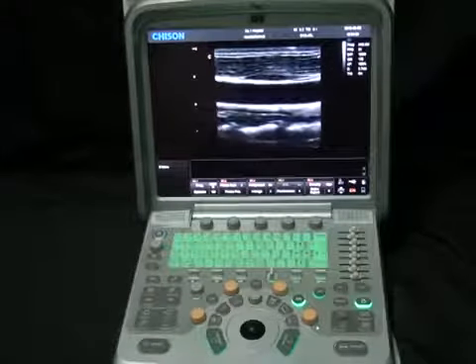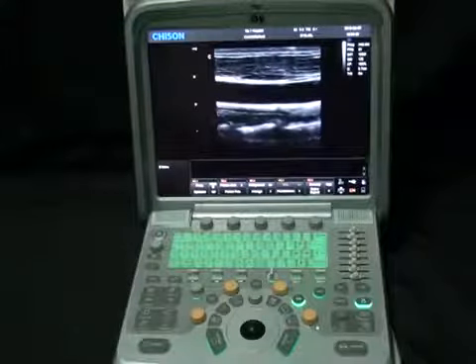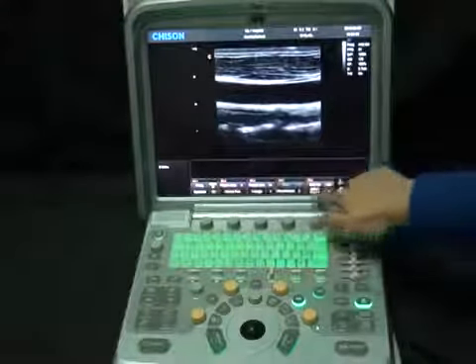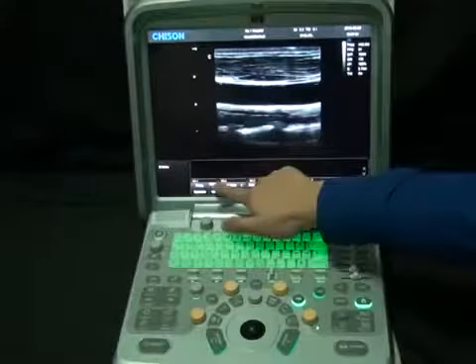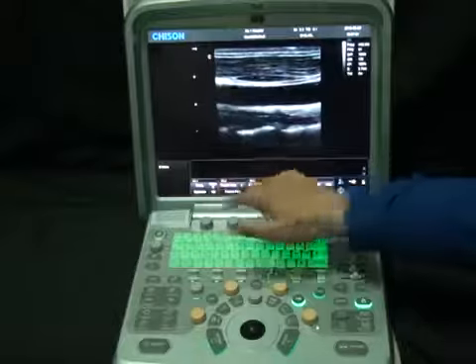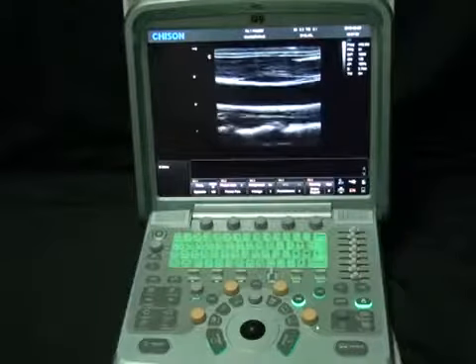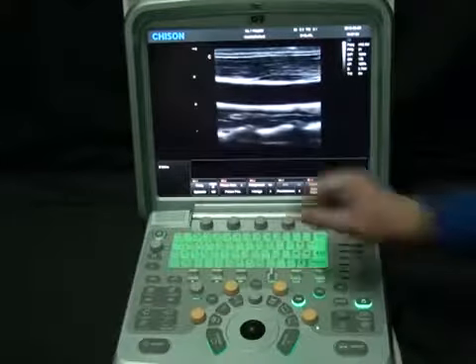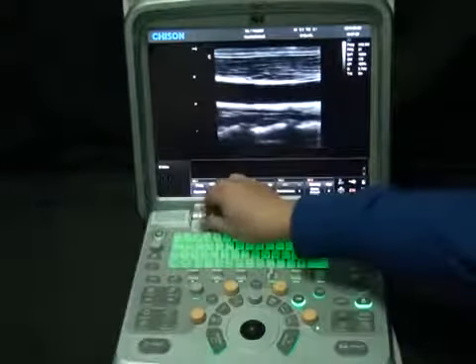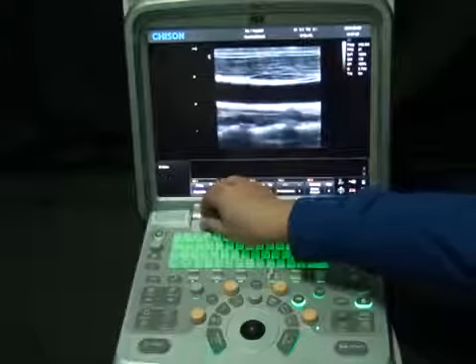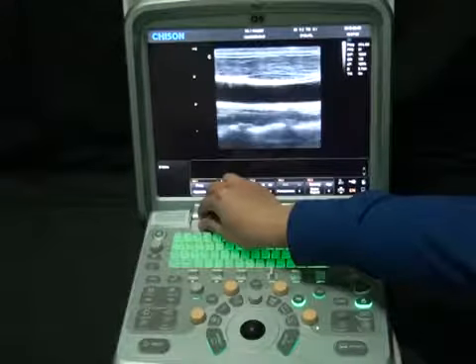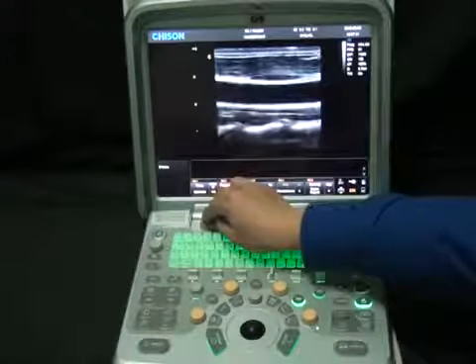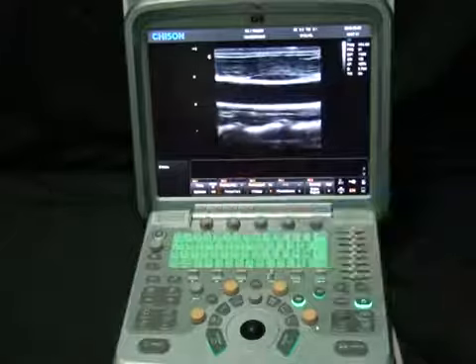Up top we have our image optimization controls: frequency, dynamic range. Twist and press the button to get a different value. For example, press this button to change the frequency and twist the button to change the dynamic range.